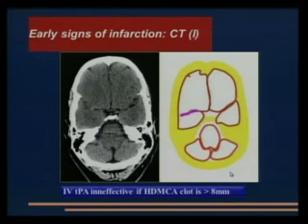This clot in the MCA that produces this hyperdensity is the indication for thrombectomy. For the minor infarcts, you will have intravenous TPA, but the major branch occlusion, these are the patients that most benefit from the treatment, you know.